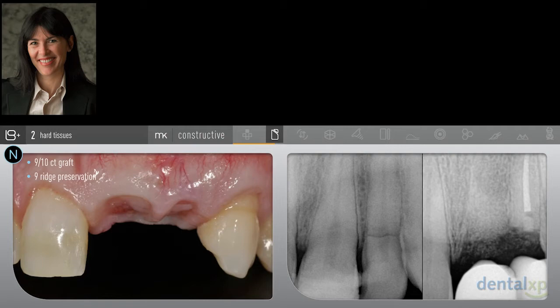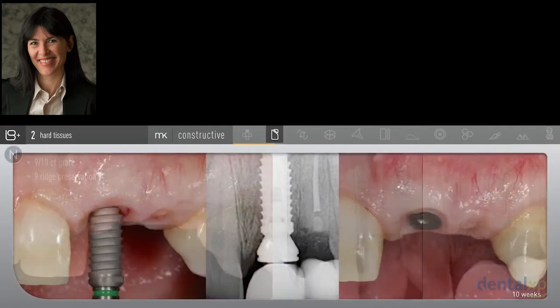But what did I do to maintain the tissue architecture in the central incisor and over that submerged root? I did a ridge preservation procedure. I've done a soft tissue augmentation procedure to help bury the root and to further improve the biotype. And I've transitioned my patient with an esthetics splint, which held the soft tissue architecture for me.